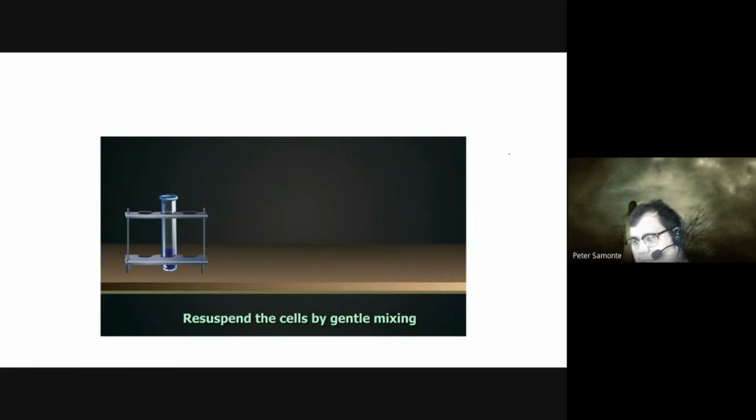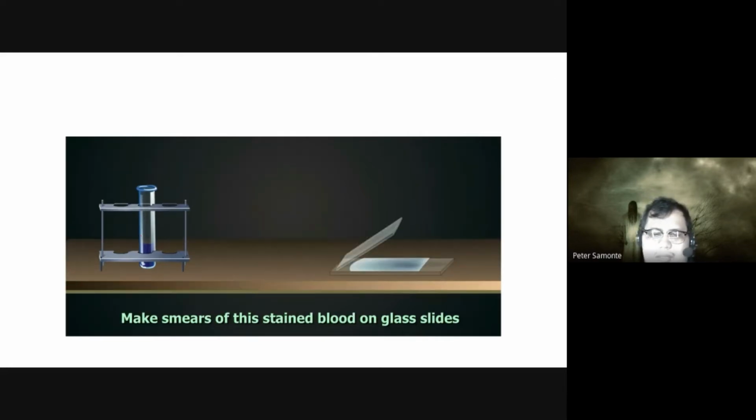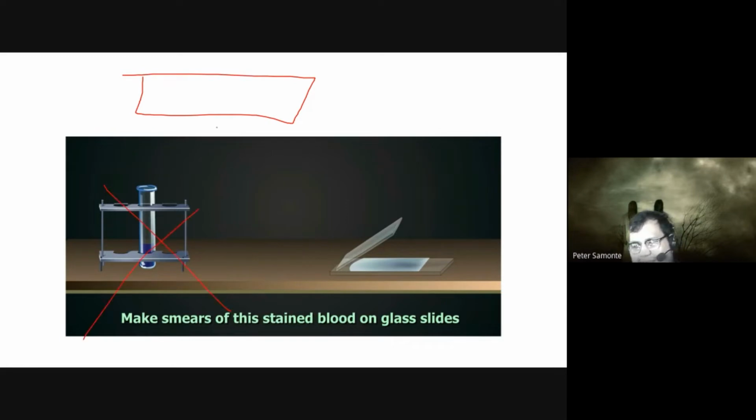Then after incubation, class, you have to suspend the cell by gentle mixing. So i-mix nyo lang yung tube. Then you make the smear on a glass slide. Okay. Sa internship nyo, class, ganito ang mangyayari. Walang test tube. Hindi niyo yan gagamitin. Hindi yan ang ituturo sa inyo.